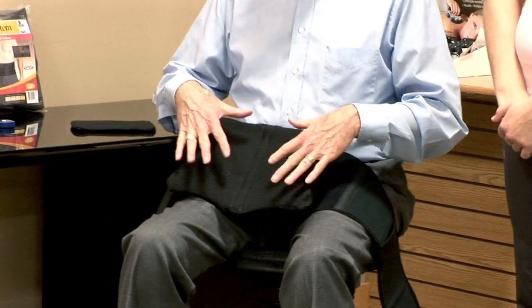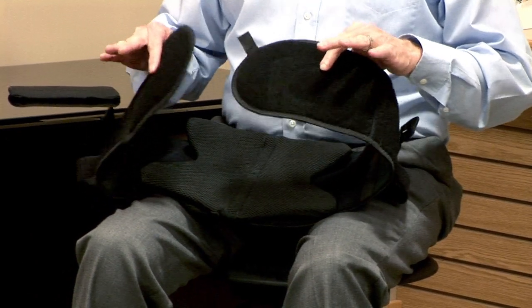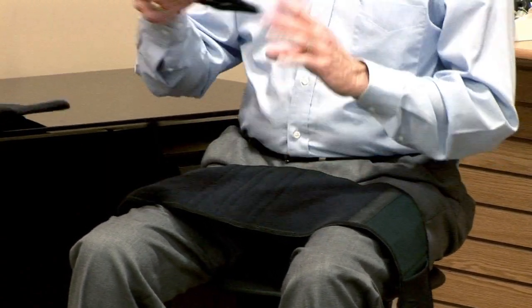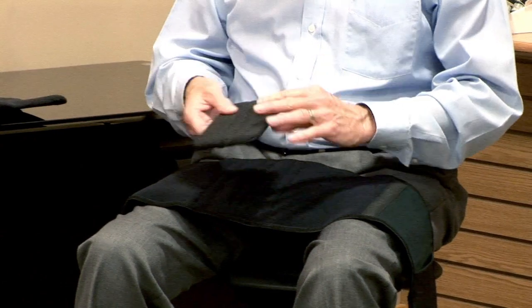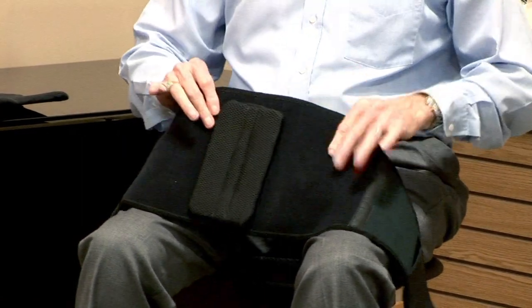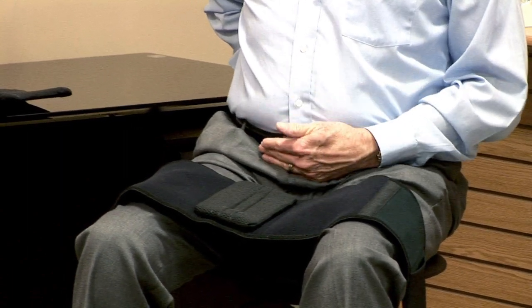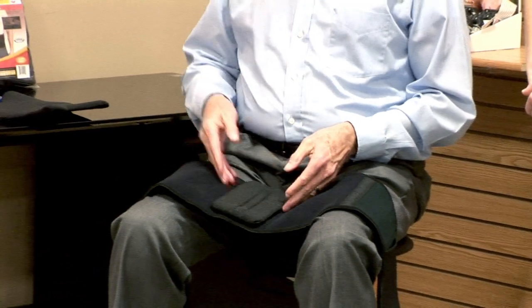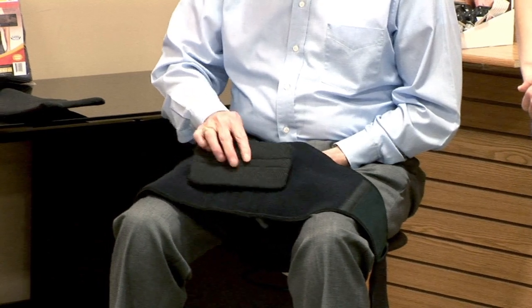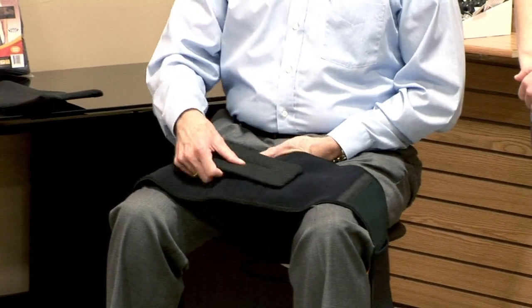This configuration is the maximum level of support used postoperatively or immediately post-injury. When the patient is ready to step down just a notch, we can take this out and use a smaller piece of plastic as the first step-down. This can be oriented vertically to help maintain a more neutral posture, or horizontally so it fits right in the small of the back, which helps the patient maintain a little more extension posture in their lumbar spine. It can go on either way.